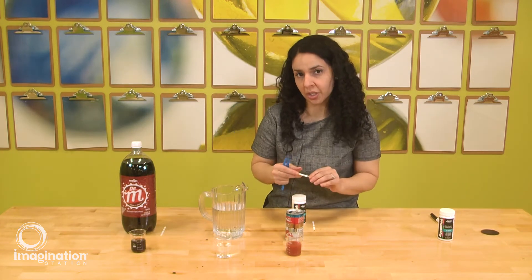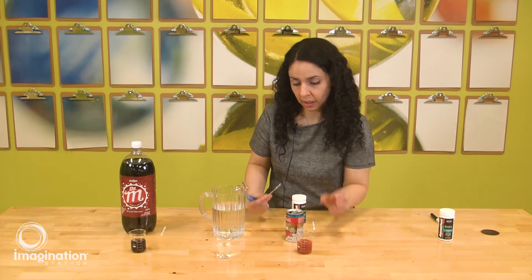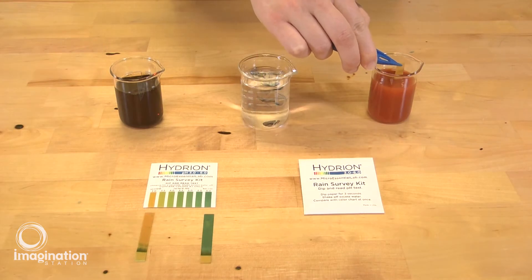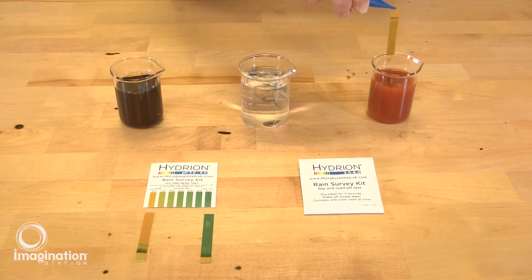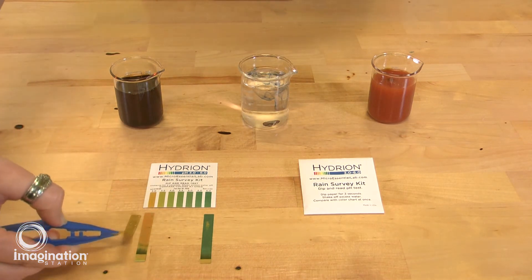Then we are going to measure the last solution — tomato juice. Same process: we insert the strip briefly, and let's remove a little bit of the liquid because the color might interfere. Comparing the result, the pH for tomato juice is around pH 4.